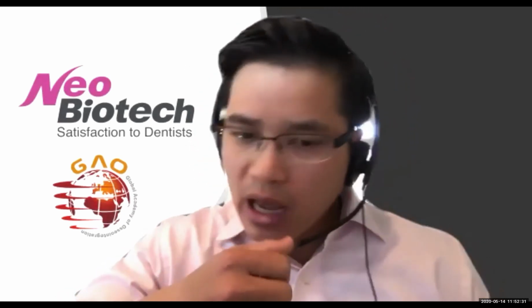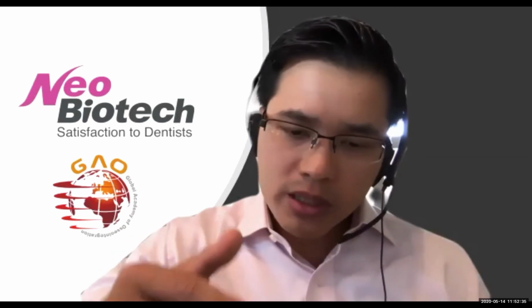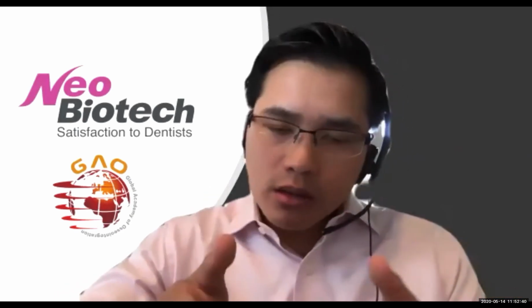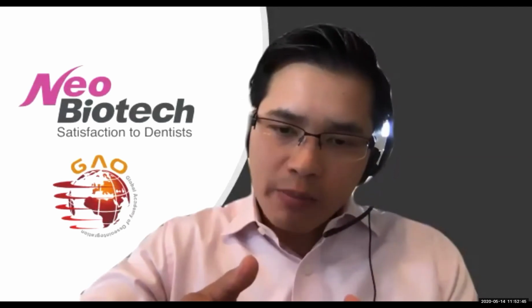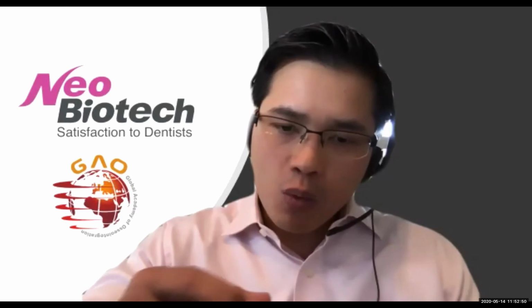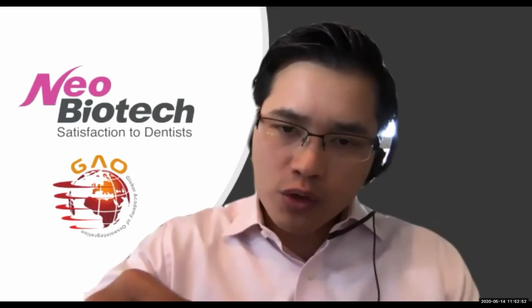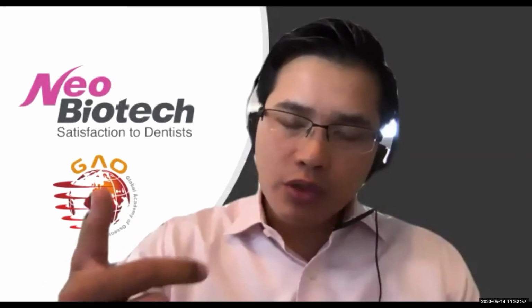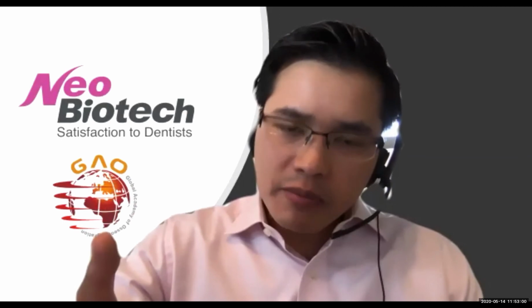Next question from Dr. Pham. What is cortical tapping? Great question. If you look at the drill that you use for drilling the osteotomy, the drill is perfectly parallel, right? But our implant is tapered with a wider coronal section. So cortical tapping basically creates a wider diameter at the coronal portion of the bone, and also puts in grooves that match the threads on the implant, if that makes sense.